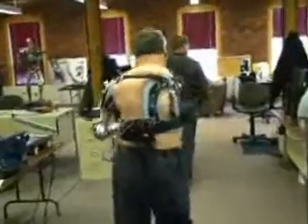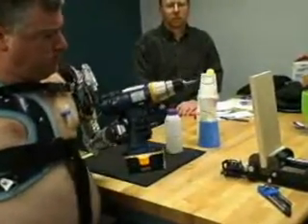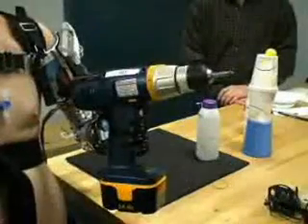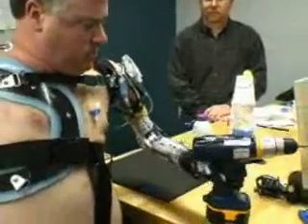The next step could be a take-home clinical trial where users like Chuck subject the arm to their everyday routines. We hope within the next two years, if we can follow the program, we can actually have a commercially available arm.